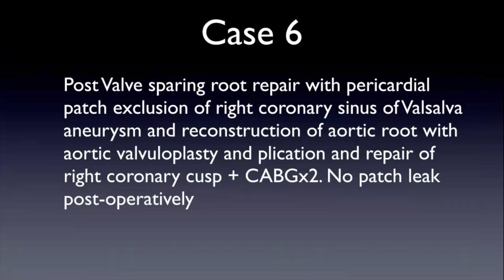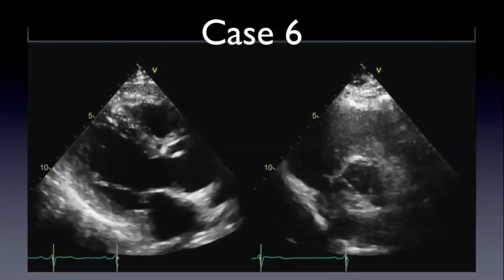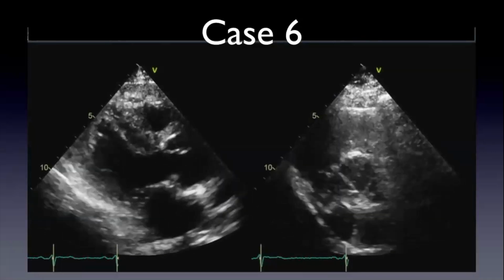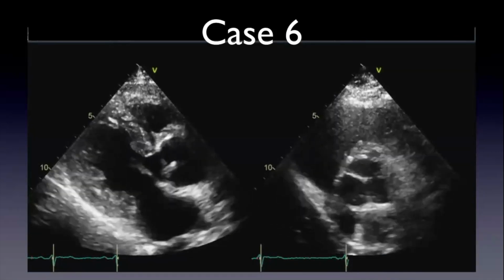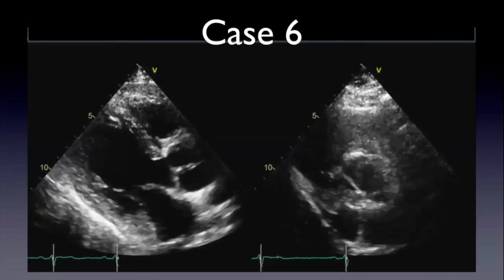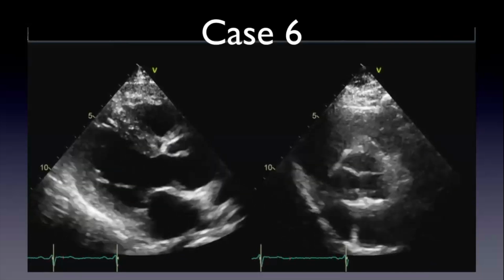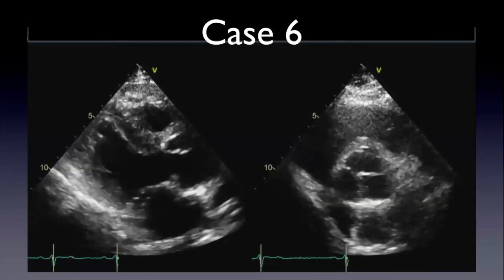All right, here's the last cool thing about this. Here's the transthoracic echo like 3 months later. Oh, no way. It just shrunk? Just resolved. And actually, Dr. Edwards read the study, and it's the only time I've ever seen this term used on a report: he says the previously reported aneurysm is involuted.